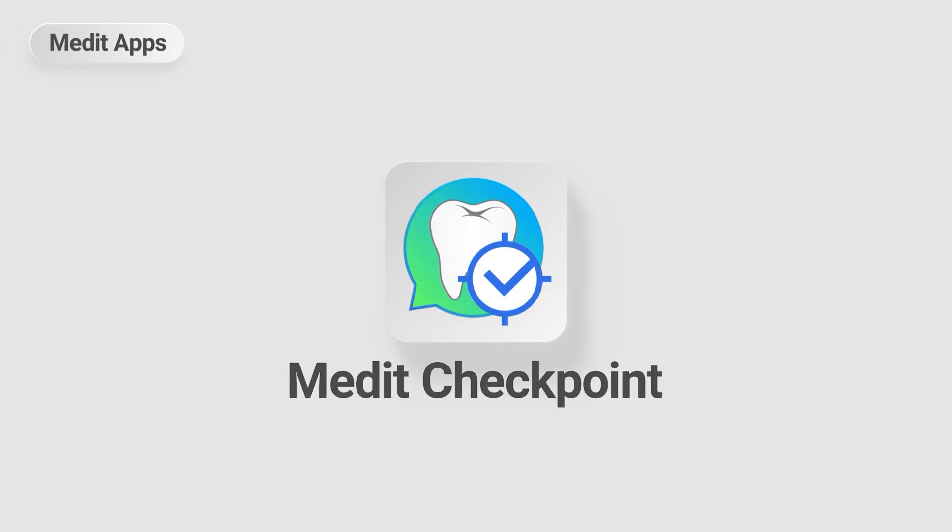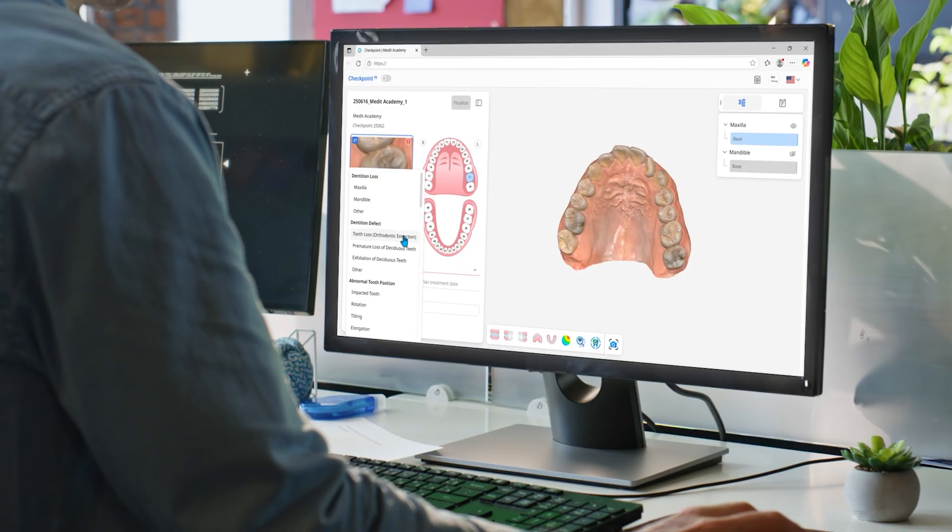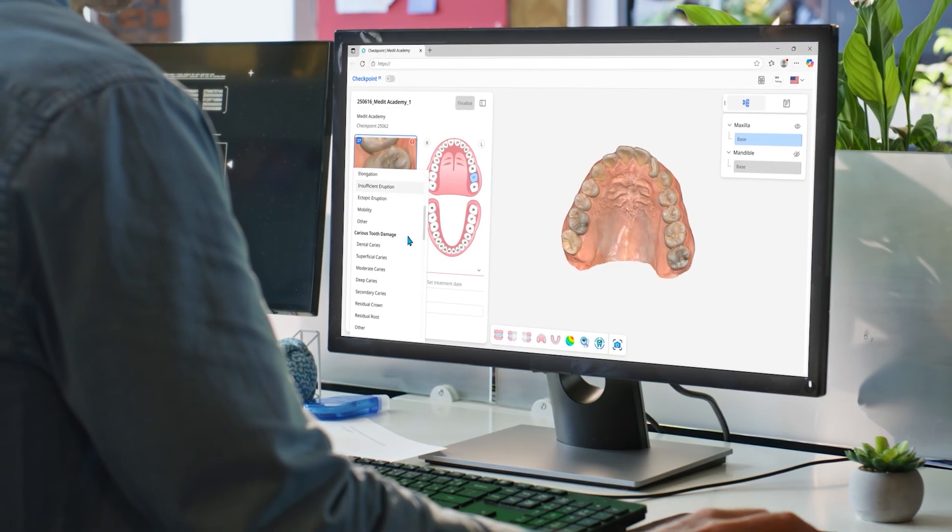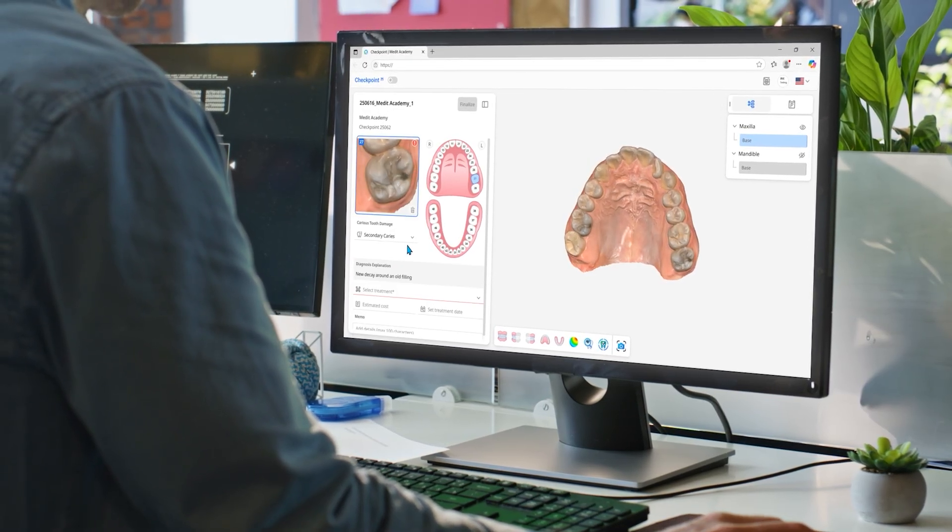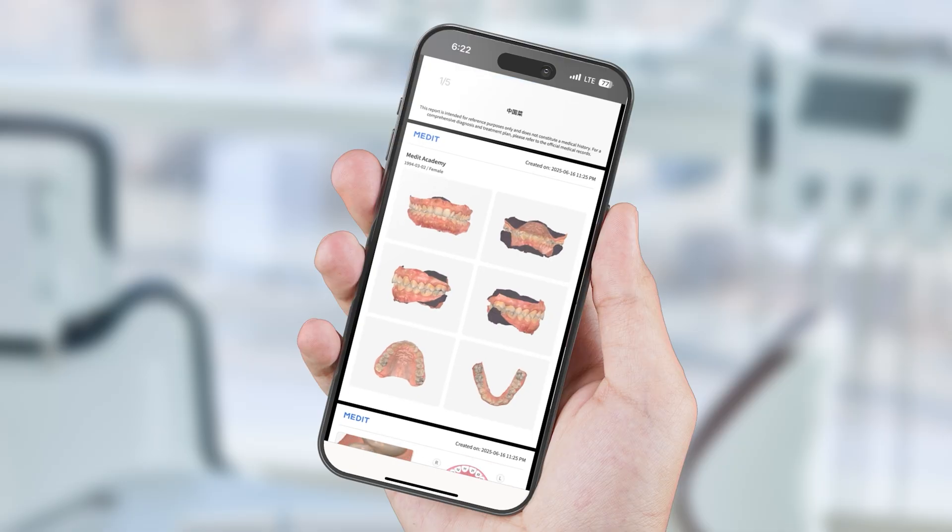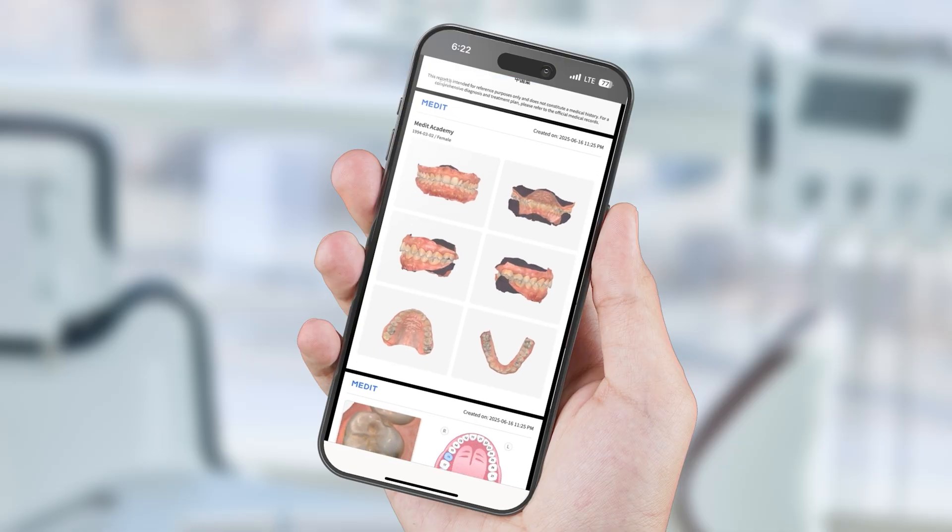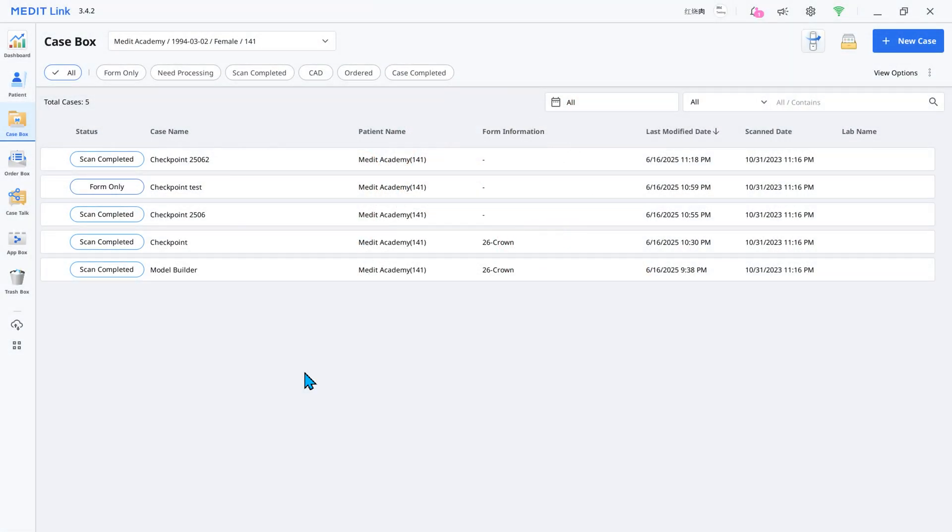Welcome to the introduction of Medit Checkpoint, our new dental report app. Medit Checkpoint helps dentists create reports easily and quickly based on the scanned data and share them conveniently with patients. Let's see how it works.